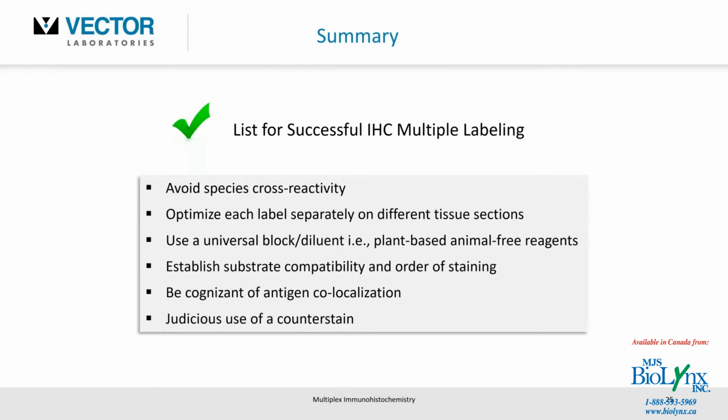Also, use counterstain judiciously, as I've indicated there, and you can certainly get trapped into masking your given target by haphazardly introducing a counterstain. So just be aware of whether or not the counterstain will actually add anything of substance to the interpretation of your data, or potentially give you some false results.